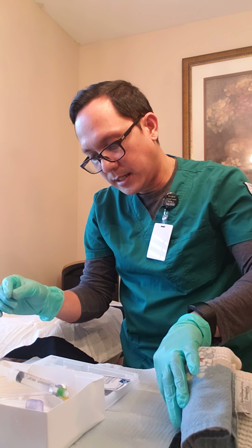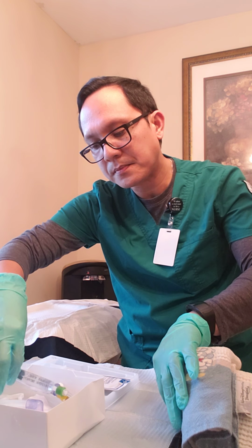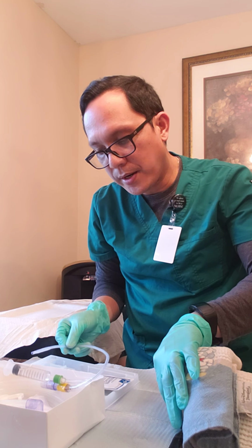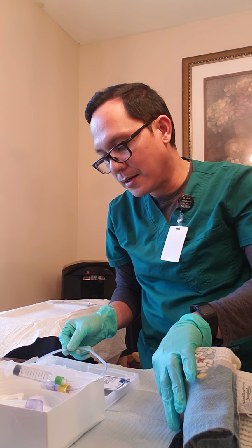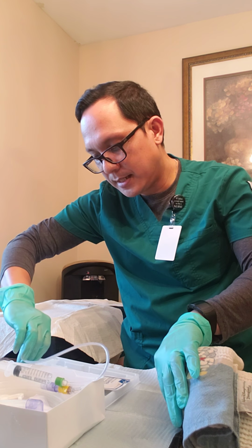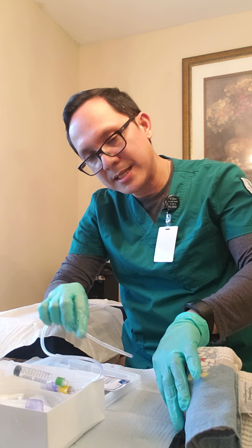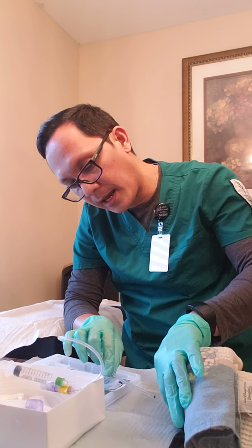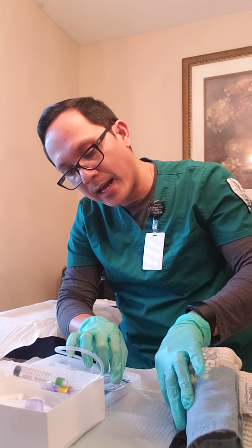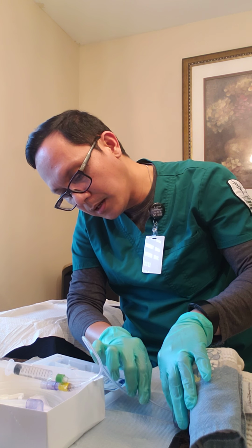Once that's all cleaned, I think I'm ready to insert the catheter. I'm going to have the patient take a deep breath once we insert the catheter. All right, Mrs. Smith, I'm just going to dip this in the lubricating jelly. All right, Mrs. Smith, we're ready to insert your Foley, okay? I want you to just bear down, just relax, and take a deep breath once we start, okay? Okay, 1, 2, 3.